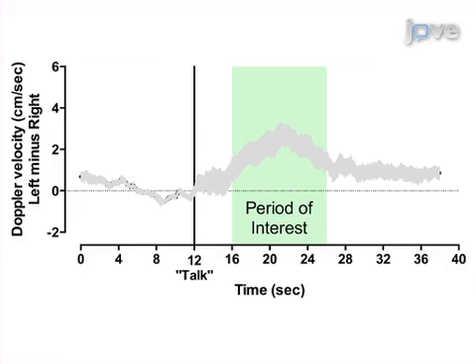Ultimately, results can be obtained that can be used to compare brain lateralization in children at different ages, or for groups with and without developmental disorders. The main advantage of this technique over existing methods such as functional magnetic resonance imaging is that the participant does not have to keep still, and the method is relatively inexpensive and portable.